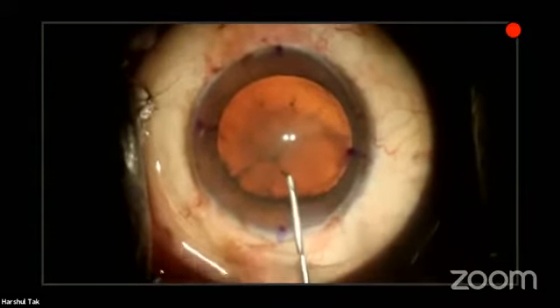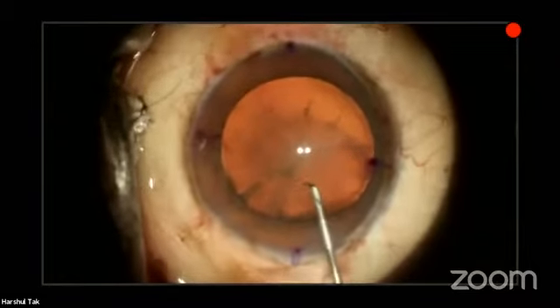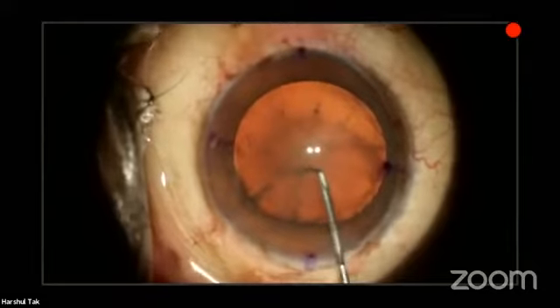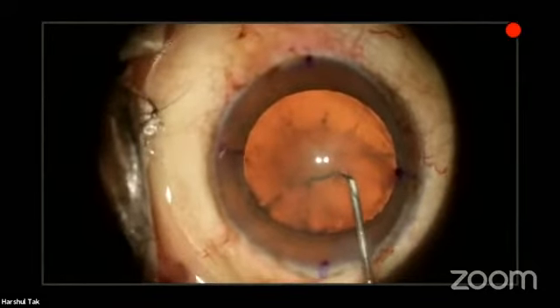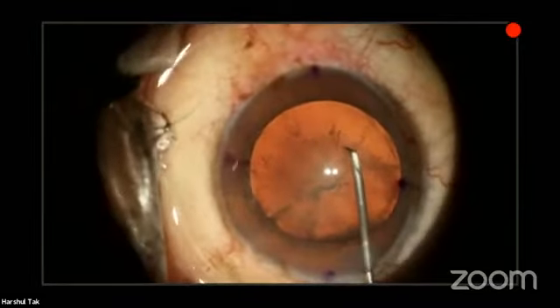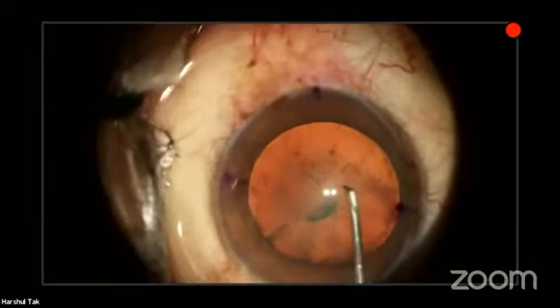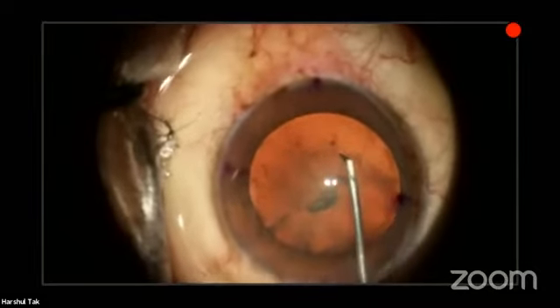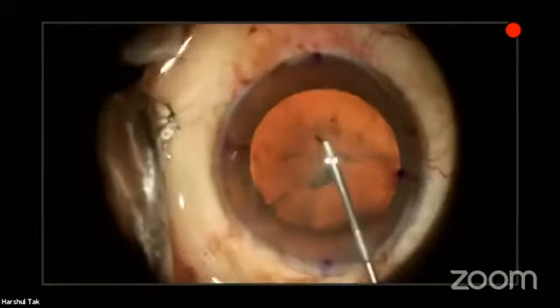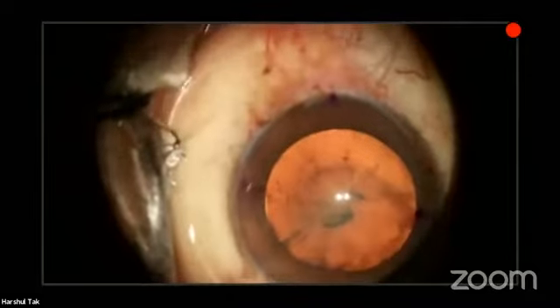So here I go and try to fashion the capsulorhexis. I give a cut here. So the sizing of the capsulorhexis, we all know, is very crucial in all these IOLs, toric and multifocal IOLs. So we need to be very careful during the capsulorhexis.